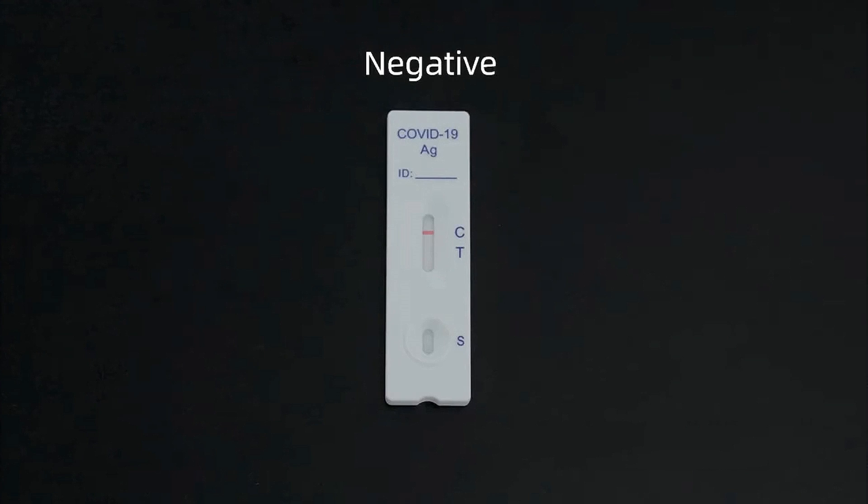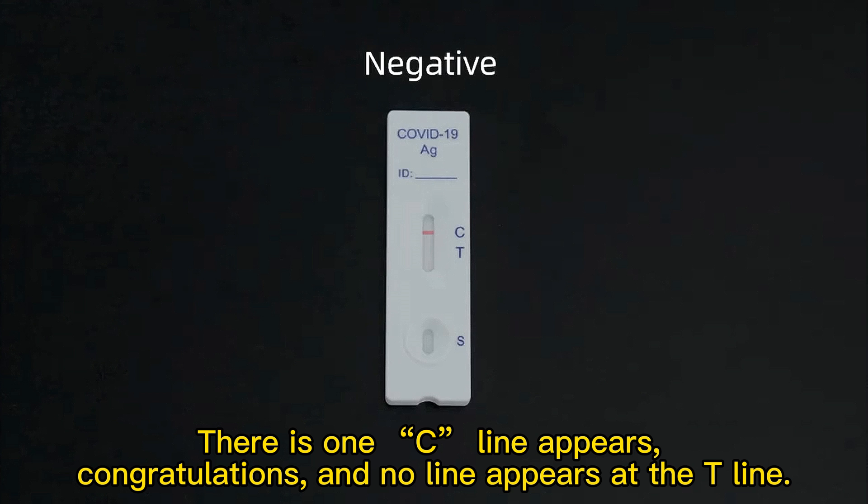Negative: There is one C line that appears. Congratulations — no line appears at the T line.